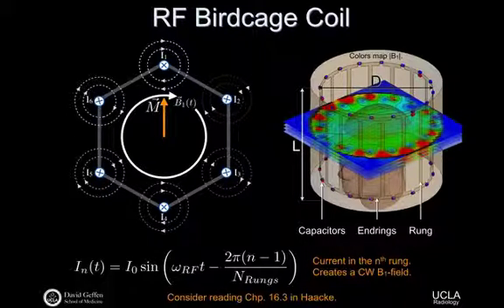It's not like turn on one rung and turn on the other rung. That's right, there's no turning on, turning off. You basically gate this current, but this I of 0 could be a function of time. At some point it's on, and at some later time it's off, but on the scale of milliseconds or something like that. Yeah?